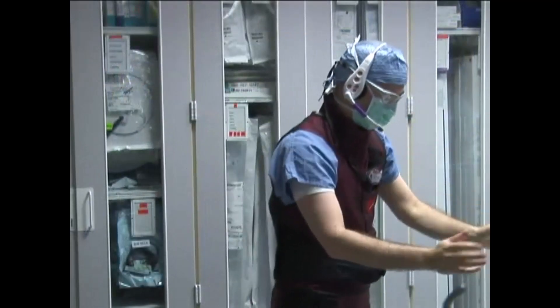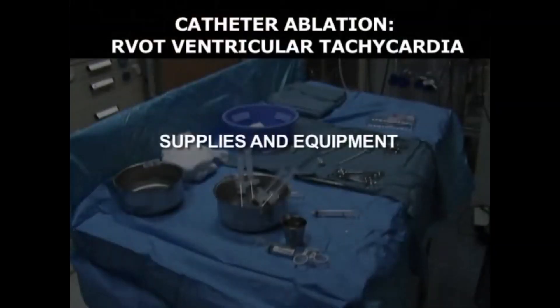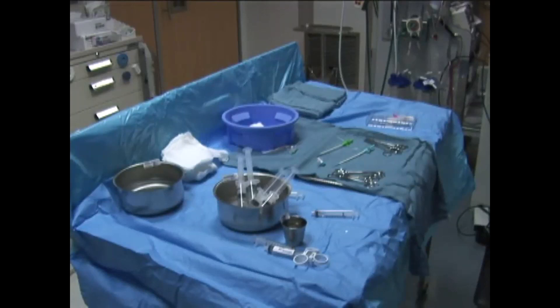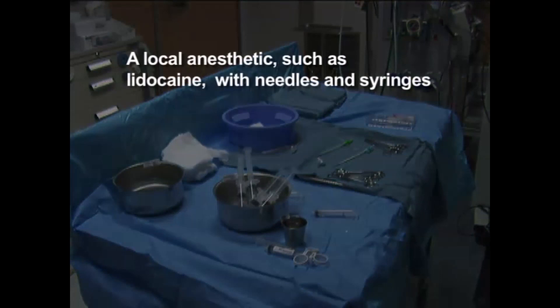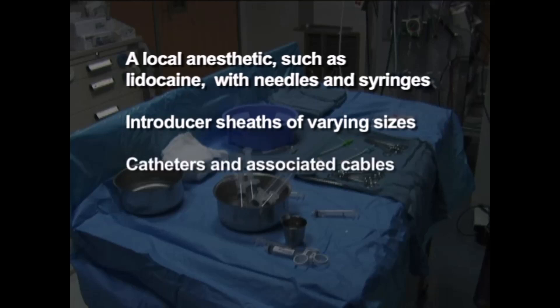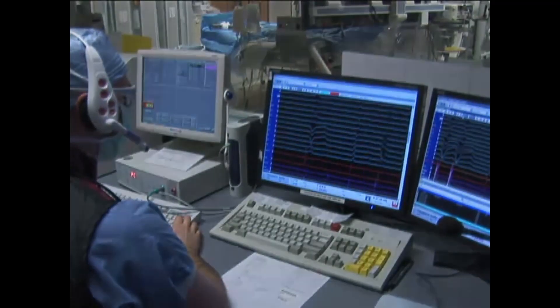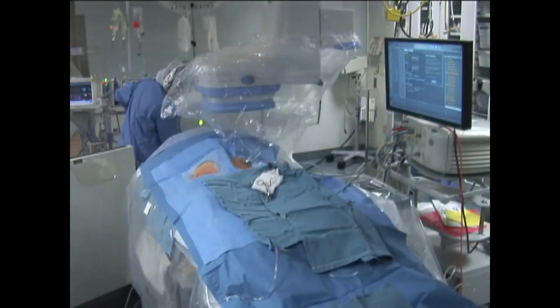The operator performs a sterile scrub and dons a sterile gown and gloves. The equipment needed for the procedure should be immediately available, including a local anesthetic such as lidocaine with needles and syringes, introducer sheaths of varying sizes, catheters, and associated cables. In addition, a recording system and pacing stimulator are needed. Both fluoroscopy and a three-dimensional mapping system should be available.